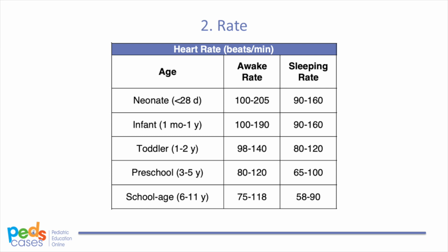Factors that should also be considered when interpreting the rate are whether the patient was awake, crying, sleeping, or whether the patient appeared generally unwell, such as being febrile or dehydrated during the time of recording. The ECG machine automatically calculates the heart rate, and it is shown at the top of the ECG recording, and can be used for confirmation.